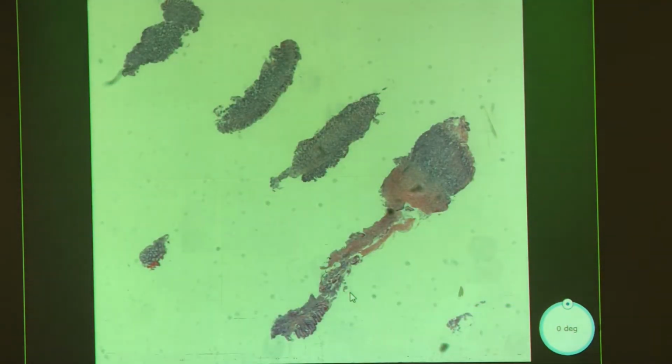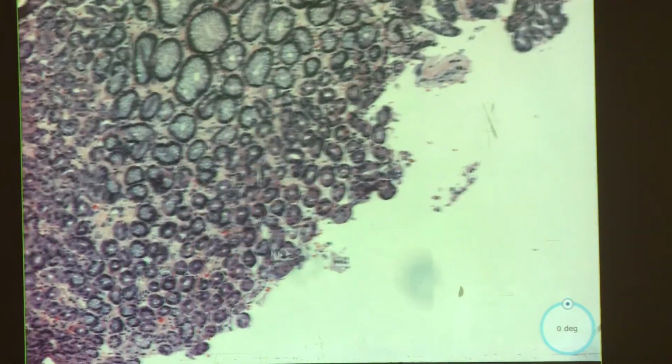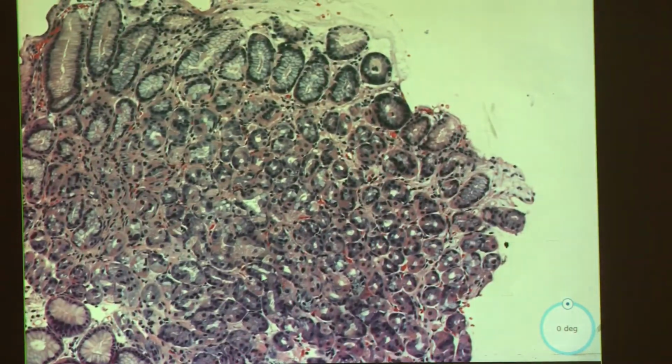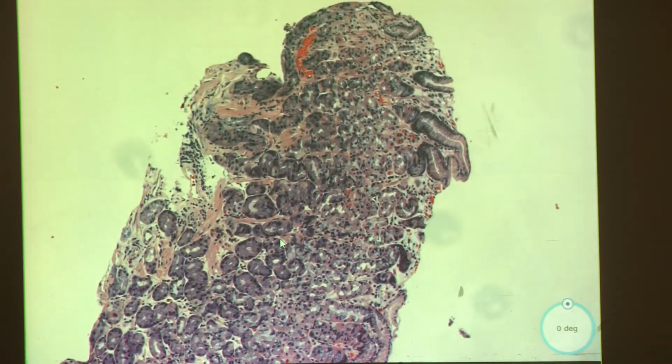Malignant lesions. And this is our last case of the day. It's very blue. So very cellular. Let's take a deeper look. This one's oriented a little funny. But we're saying malignant lesion, so there's definitely malignancy somewhere right around here. Yeah, so now you have to find it.